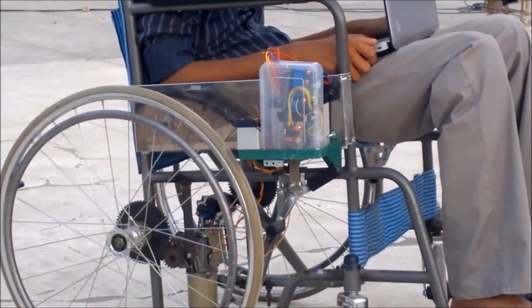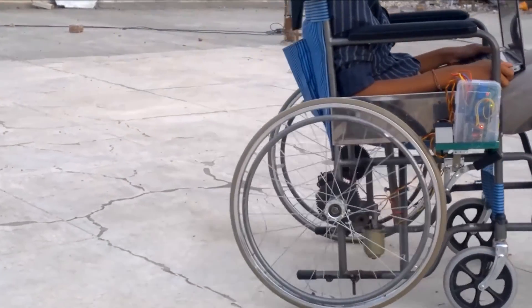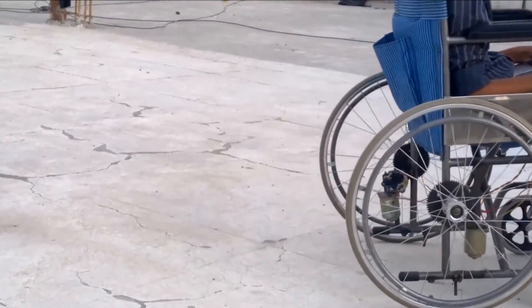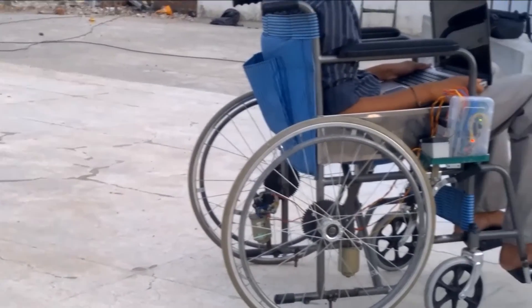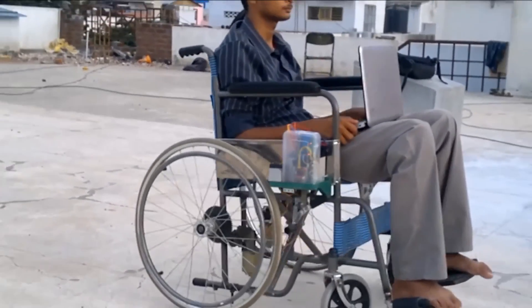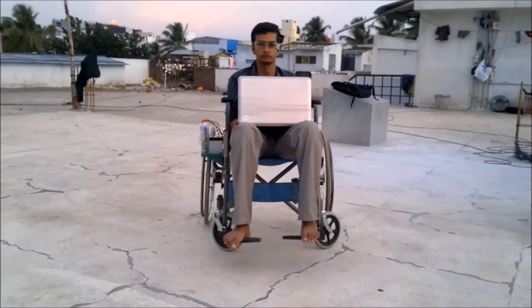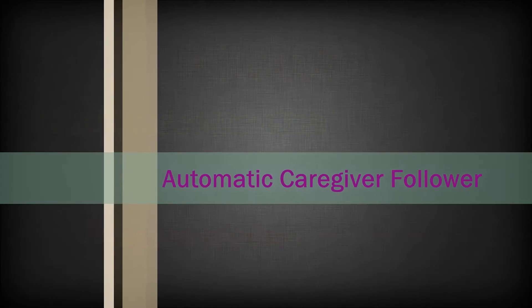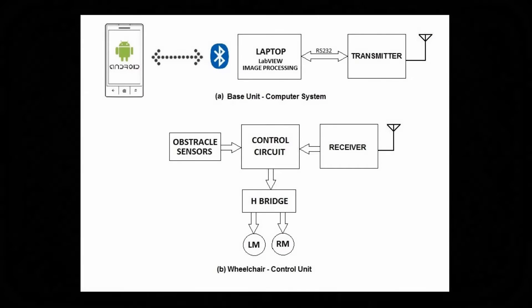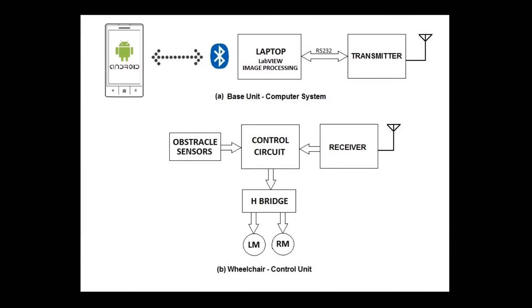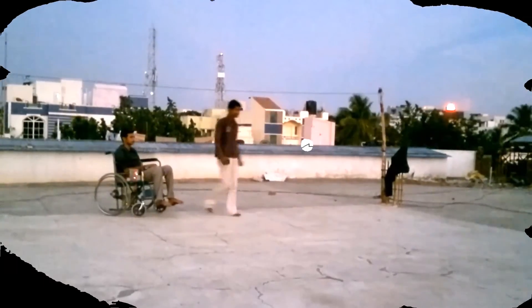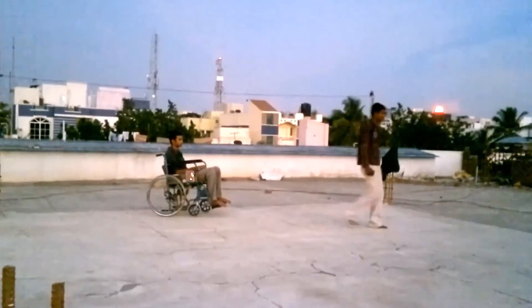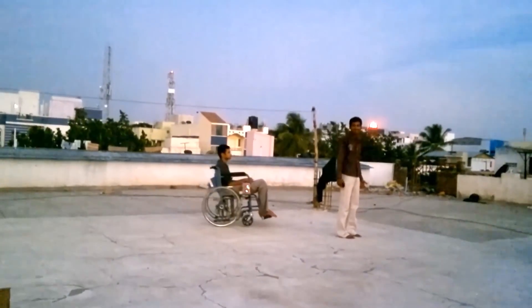This is the control unit of the system, which receives signals from the laptop and correspondingly drives the motors. When the caregiver wants to take the patient outdoors, it isn't necessary for them to push the wheelchair. Instead, this system can track the caregiver and follow them automatically.